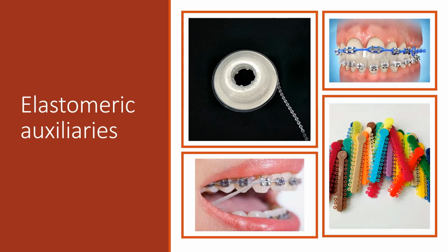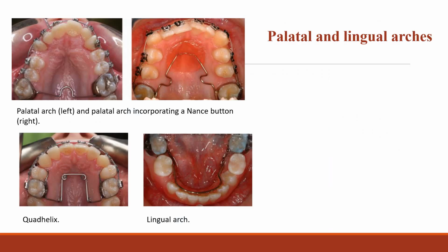Metallic products include lengths of coiled spring made from stainless steel, cobalt chromium or nickel titanium, which in an open configuration is described as push coil.